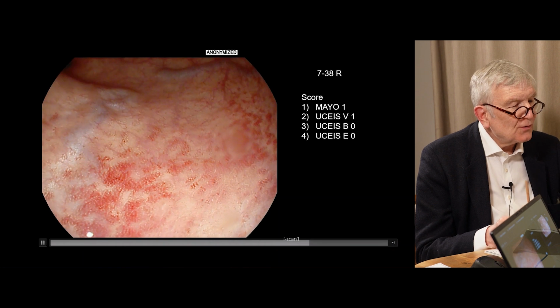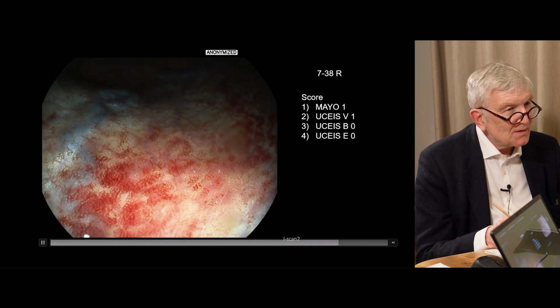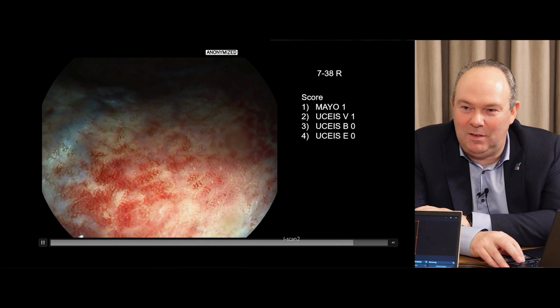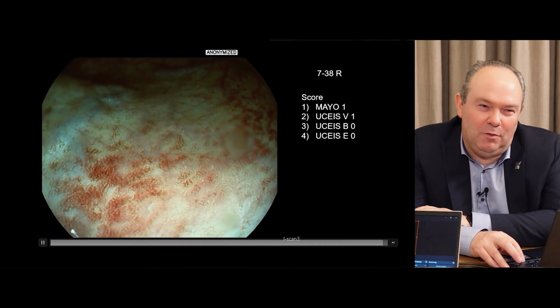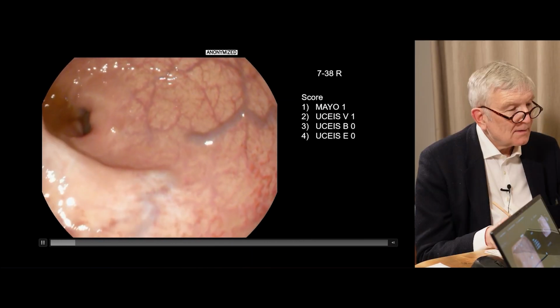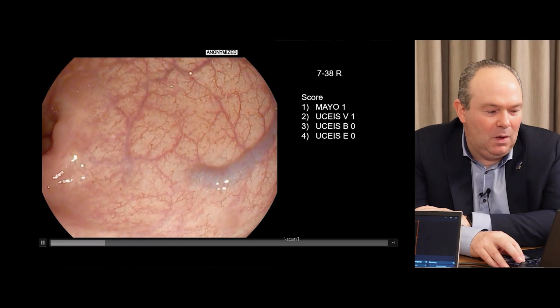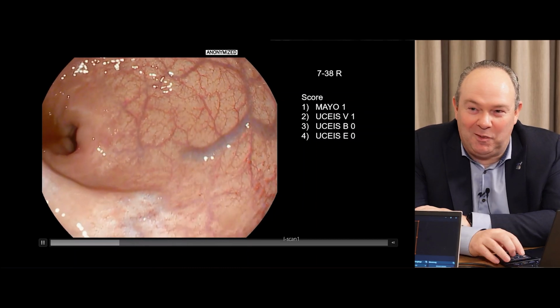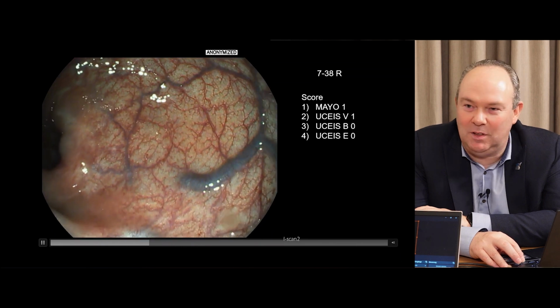What would you do if you find this during a screening colonoscopy and the patient doesn't report any symptoms? I probably take a biopsy here. Yeah. You might probably miss it on the way in. So if the patient has diarrhea, we always do the IBD biopsy protocol. So that means you take 2 biopsies in every segment of the colon and the ileum. But you're very likely to miss that, I think, if it's just 5 centimeters of distal rectitis. But then I would definitely take biopsies here.